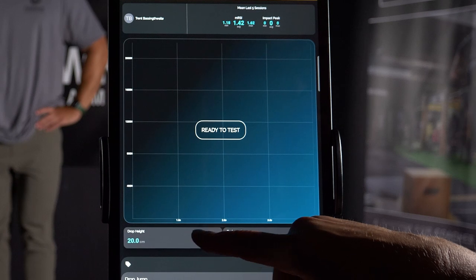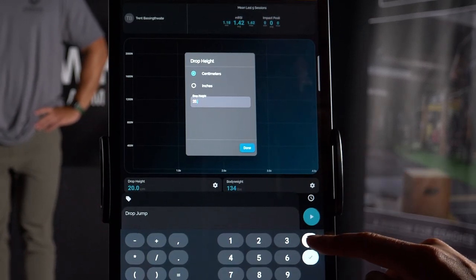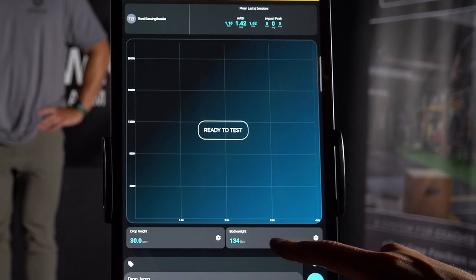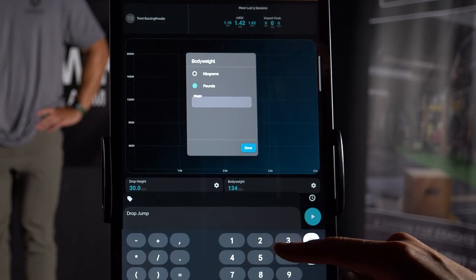Make sure to accurately measure the box height and input into the drop height section. If there is no bodyweight automatically registered into the bodyweight box, weigh the athlete and input manually.